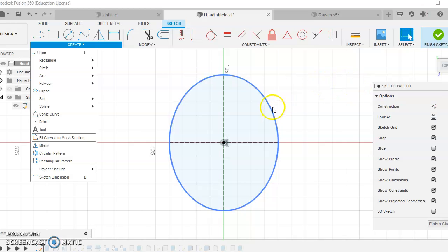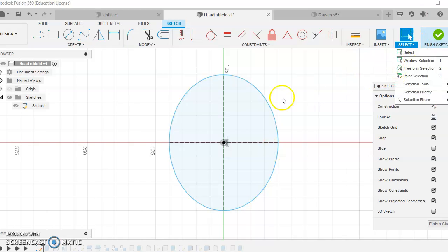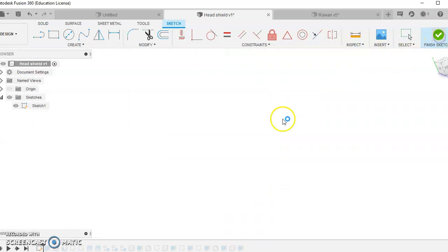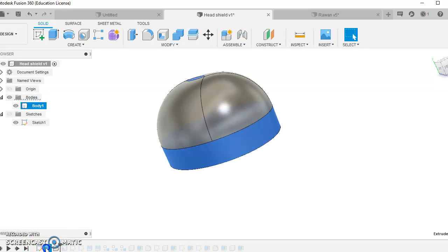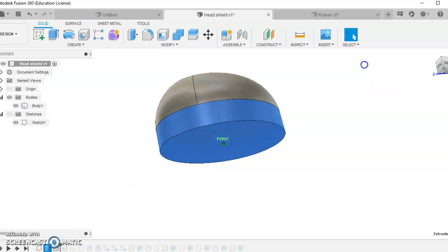Now we can enlarge that in reality, and what you do, you just make a strap on the back of the shield that can be adjusted. So I've gone for the 60th for now, which should be good. Anyway, once that's done, you extrude it. Now again with the extrusion, I'll show you here, the extrusion element. Now I know that the measurement from your forehead to the top of your head is approximately 130. So we extrude that 130. So you've got the dome shape here.